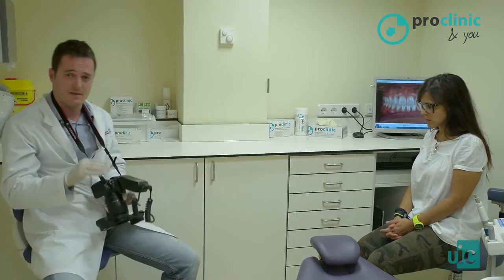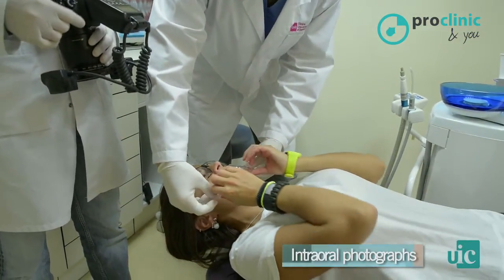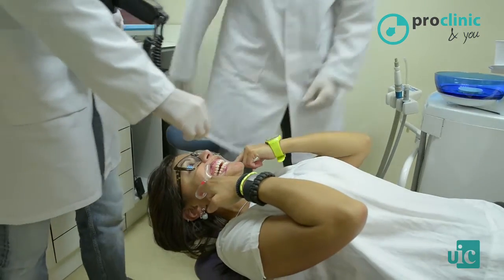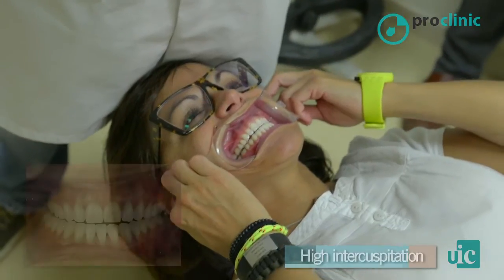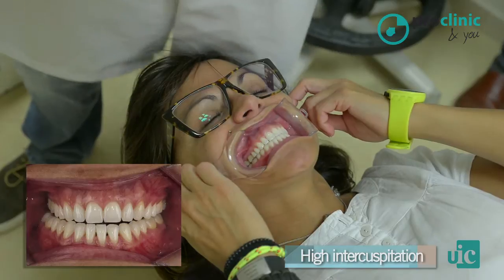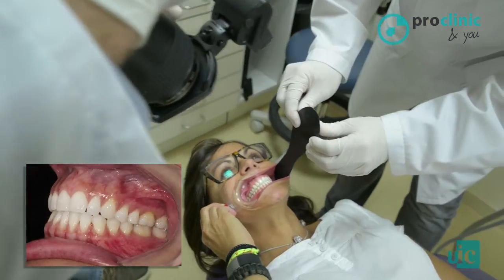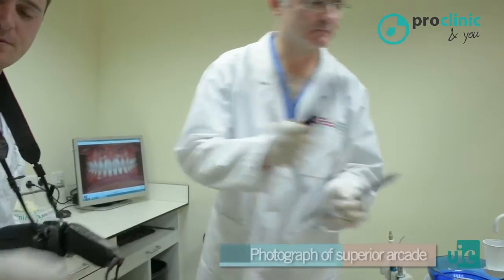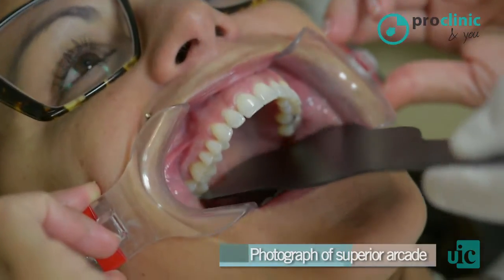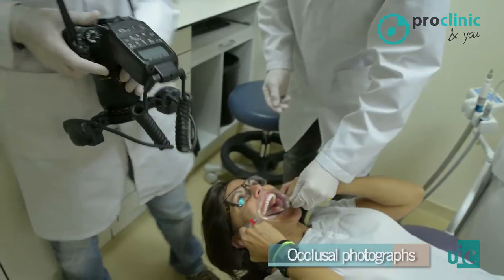We will perform intraoral photographs with the patient sitting on the chair and we will place lip retractors. Photography in high intercuspation. Side photographs, right and left, with the help of a contrast. Photography with contrast of the superior arcade. Occlusal photographs with a mirror, top and bottom.